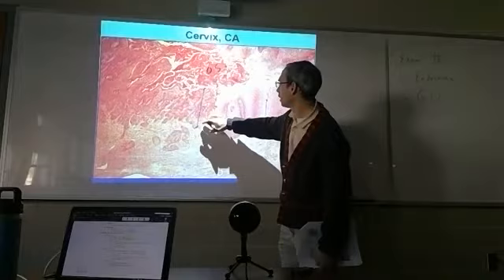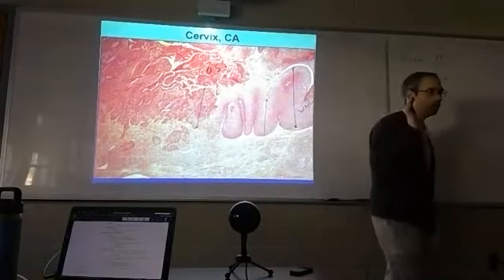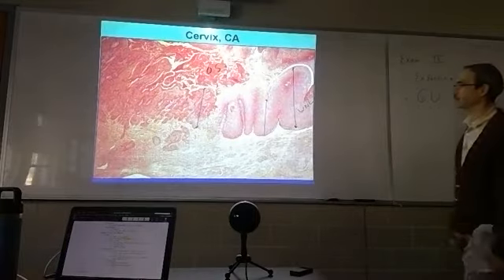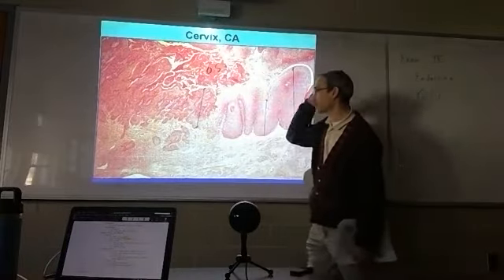You go over to the left, and you'll notice there is an area where you have full thickness hyperchromasia, full thickness dark staining. That's because all the cells are crowded in that area. They're overcrowding. Clearly, that's a neoplasm. All crowded together, they're not maturing properly.